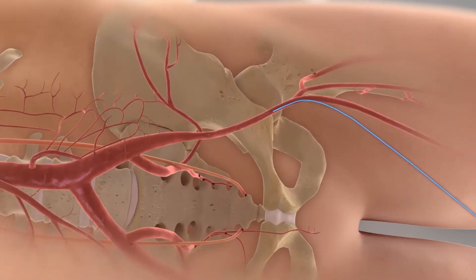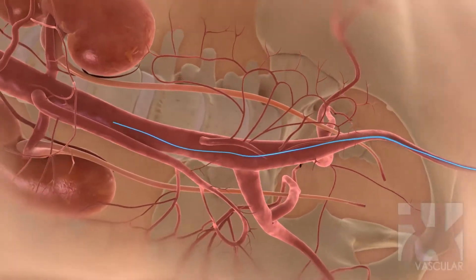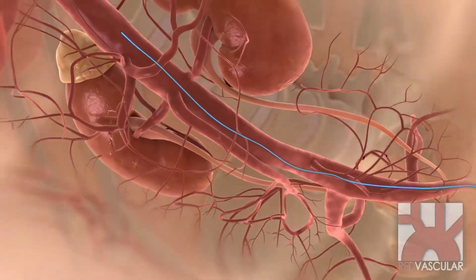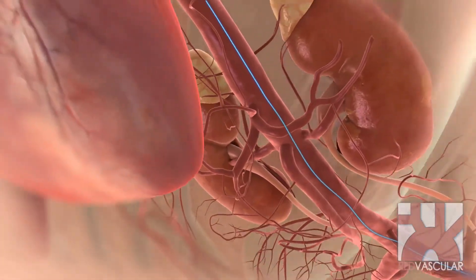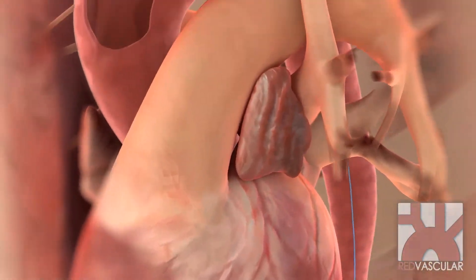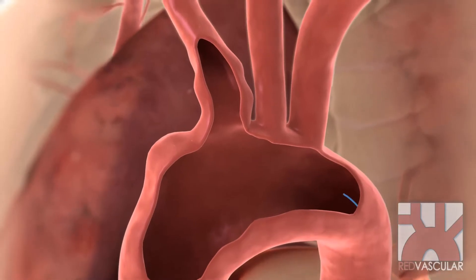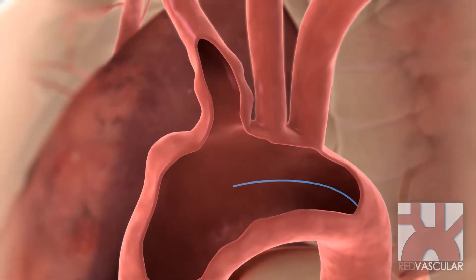Here's how to treat an aortic arch aneurysm that involves the brachiocephalic artery, which we'll call the branch artery. First, place the main guide wire into the aorta from an access site such as the femoral artery.